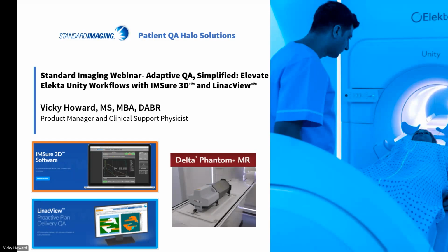It requires some data measurements. Some you can get from the commissioning data you probably already have, but basically what we need are profiles and output factors for a range of field sizes from you. So we do ask for output factors down for smaller field size. We also need some diagonal profiles. But once you get that to us, the value in the modeling process is excellent.